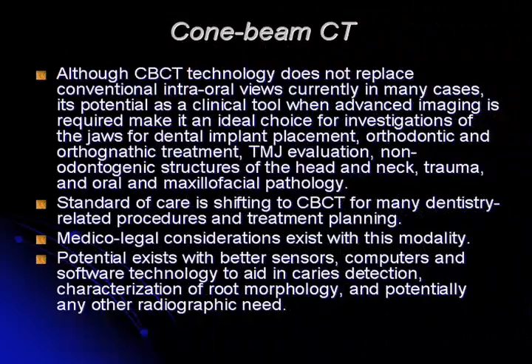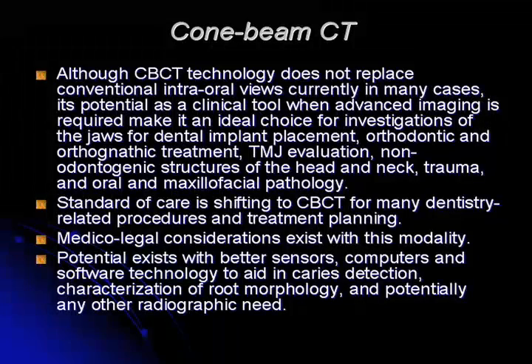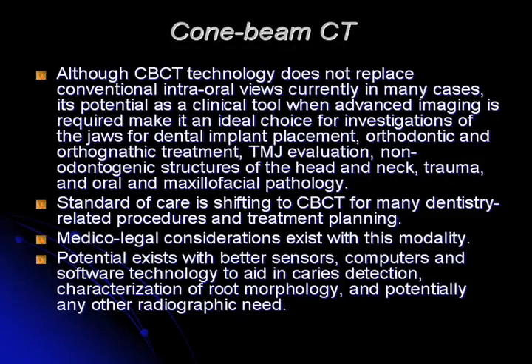The standard of care is shifting to cone beam CT, and that's going to happen. It's happening now, and it's not going to be a very long time before in dentistry and dental-related procedures and treatment planning, it is the standard of care over any other imaging studies. And why, if you think of some of the reasons for that, is the radiation that you get from it in one volume is very low. So if you just do one cone beam CT, that's your baseline imaging for anything you need for the patient.